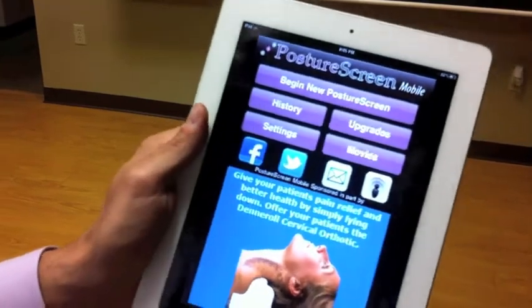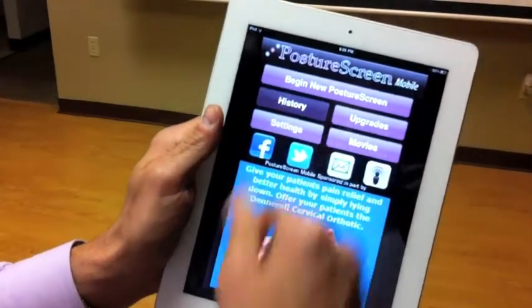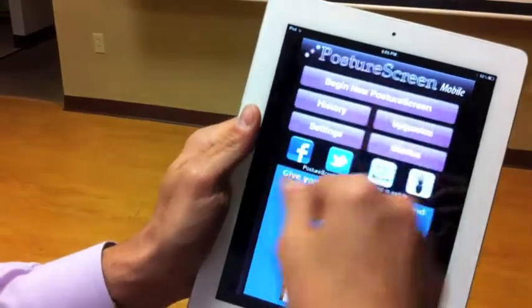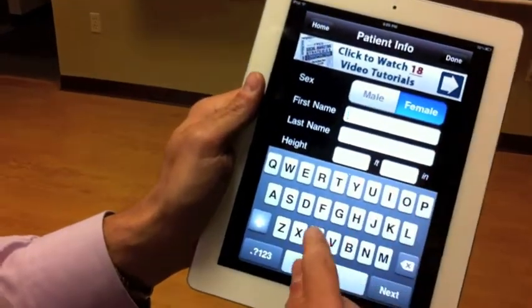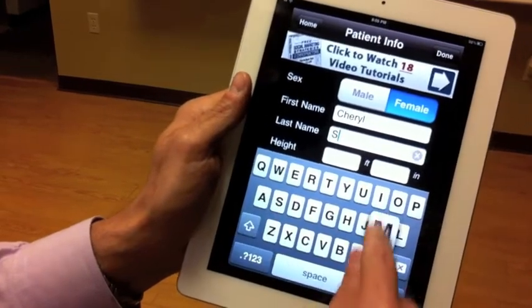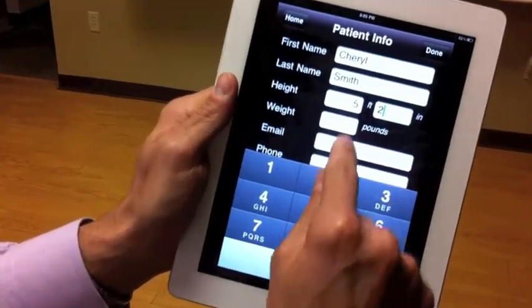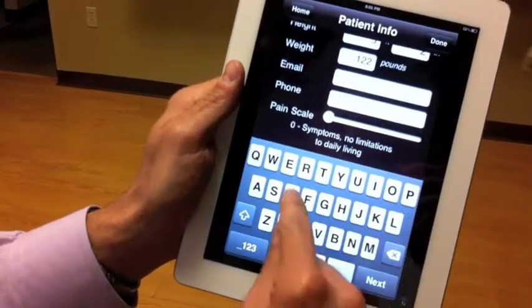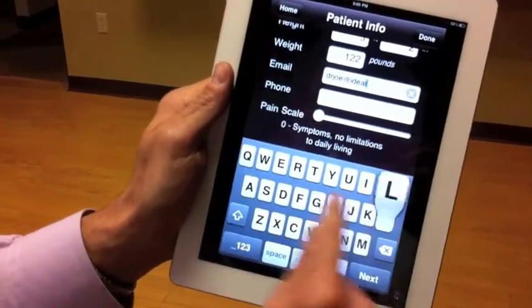Let me show you how this works. I'm going to go through a screening with you. These are the people that have already been screened — let's start somebody new. We're going to go ahead and put: she's a female, Cheryl Smith, she is 5'2", she weighs 122. And her email — let's go ahead and put my email just because I don't want to bother my sister-in-law.